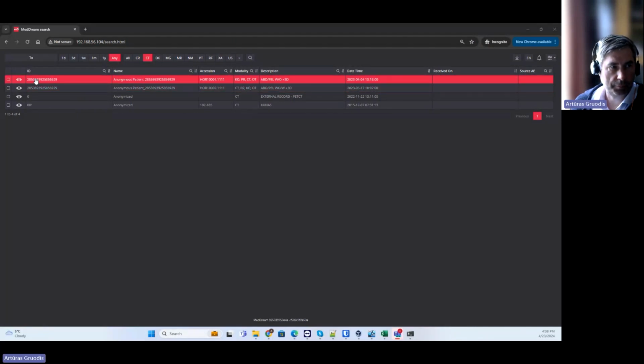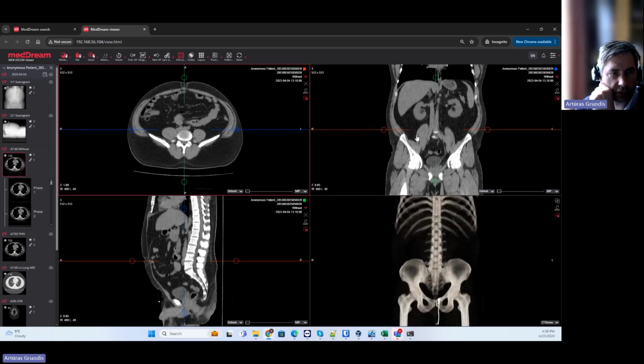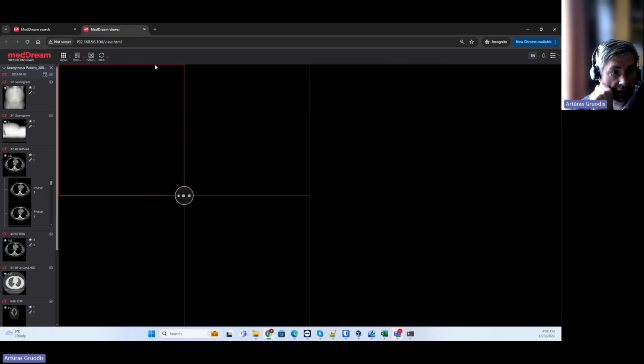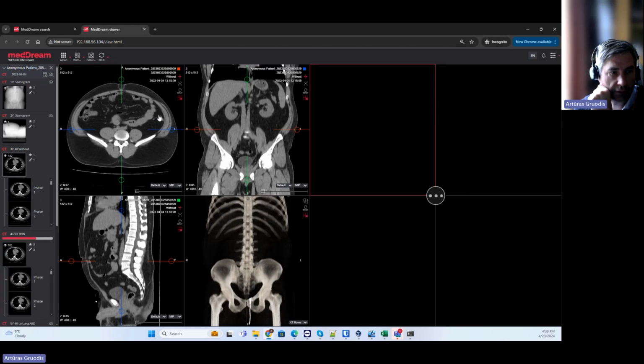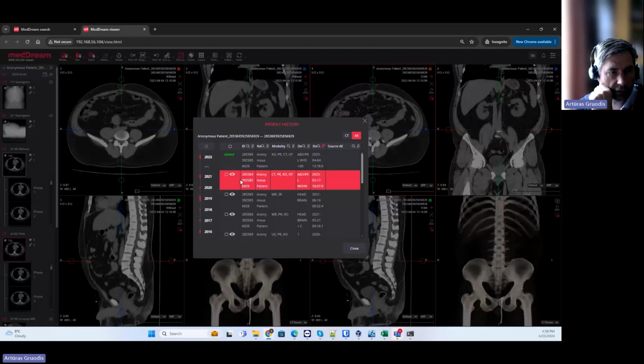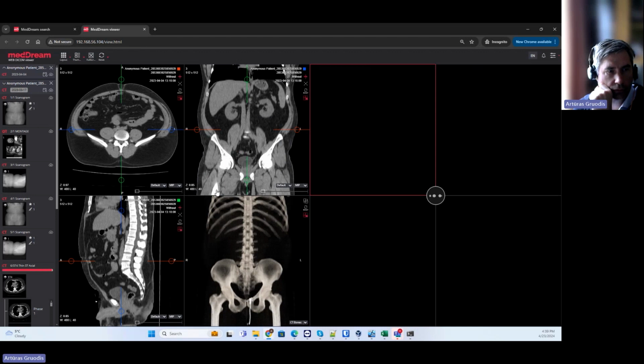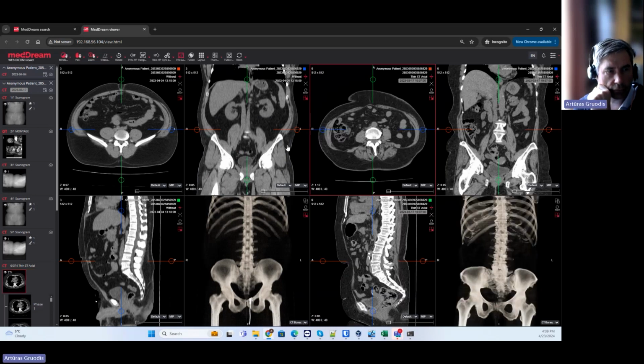Right now I will open a CT study, and I have a hanging protocol configured which opens the MPR view automatically. I have another hanging protocol which allows you to open 2 series and have 2 MPR views. And the last hanging protocol I want to show you is that once I am adding a comparison study, MedDream will show the MPR view for the current study and for the comparison study.